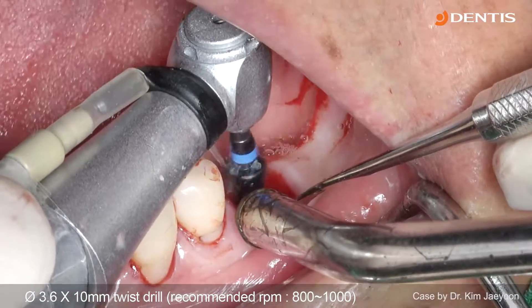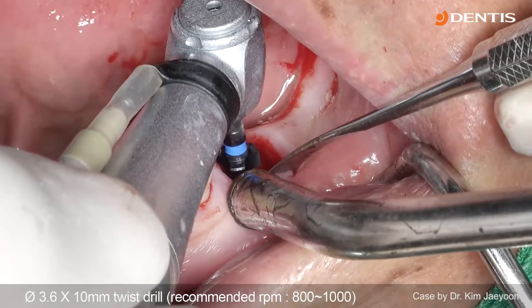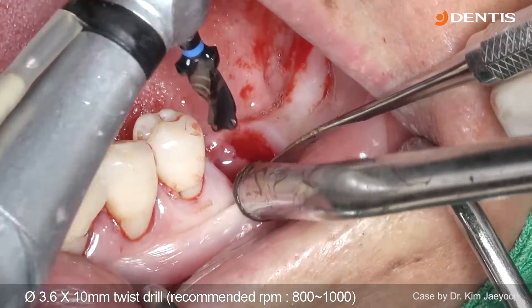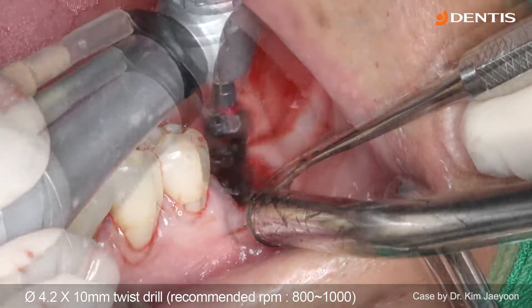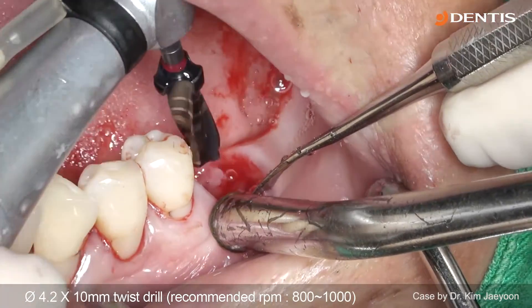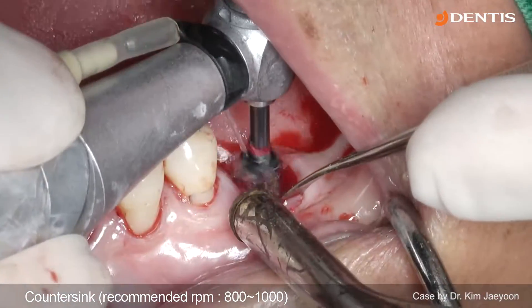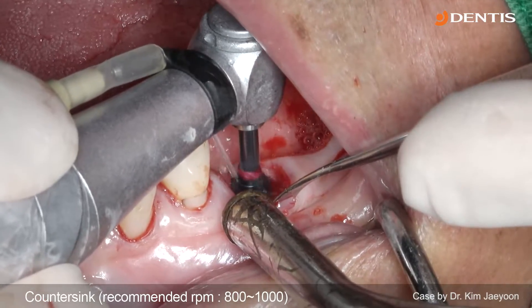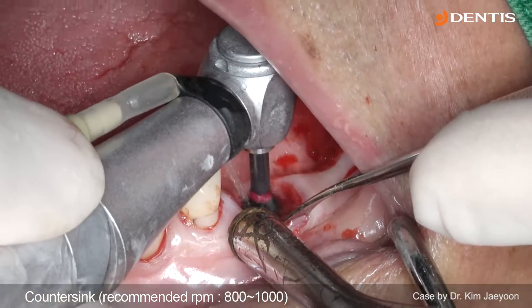Because I want to place the wide-size fixture, I step up to the wide-size twist drill. Then I use the countersinking drill because there is very thick cortical bone.